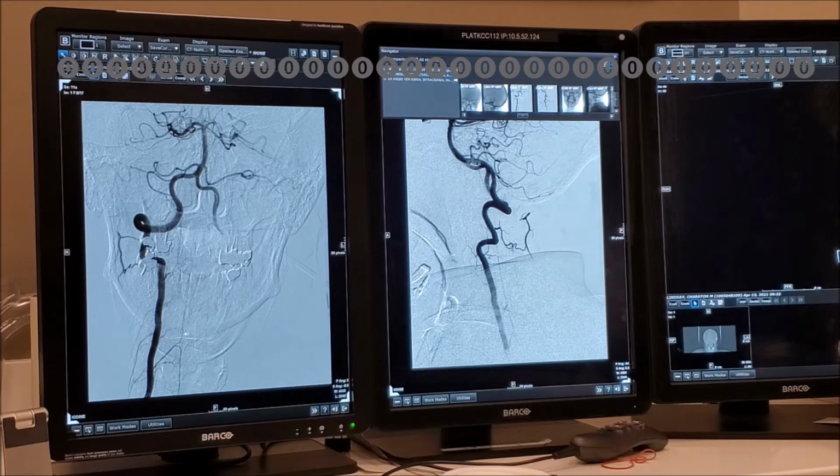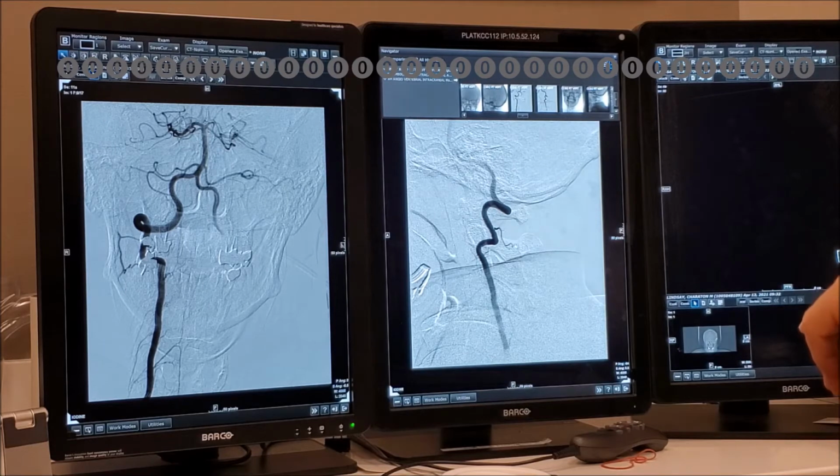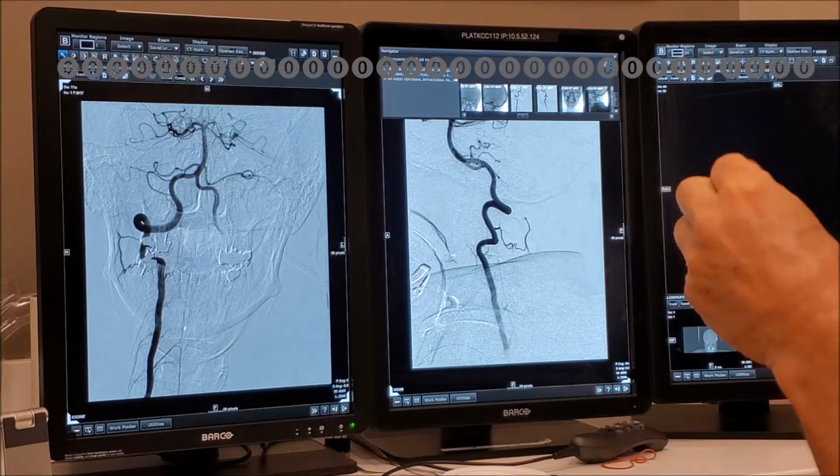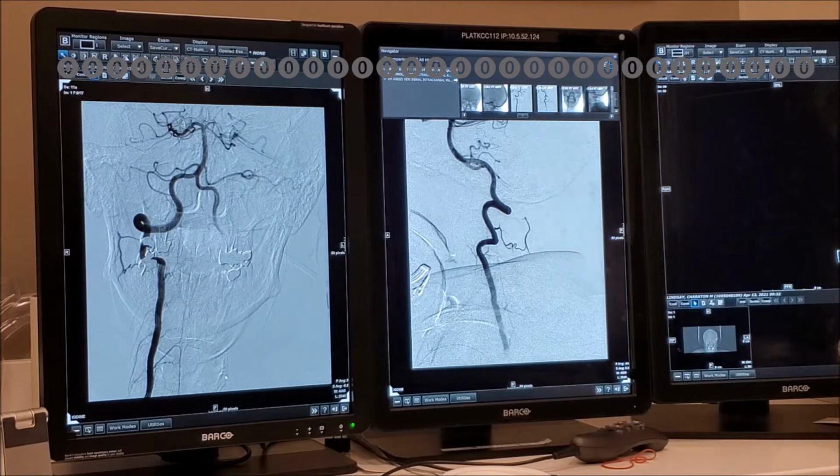So you should look at it in the midline views, and then you have this. Not too bad. You have the collateral with the right. And then here you can see this is the posterior part of the canal, this is the ventral. One interesting thing is we can predict from this picture that there will be a fenestration on the opposite side of the anterior spinal artery. You see this thing? So if you did the other side, we're probably going to see another artery coming and filling this triangle.